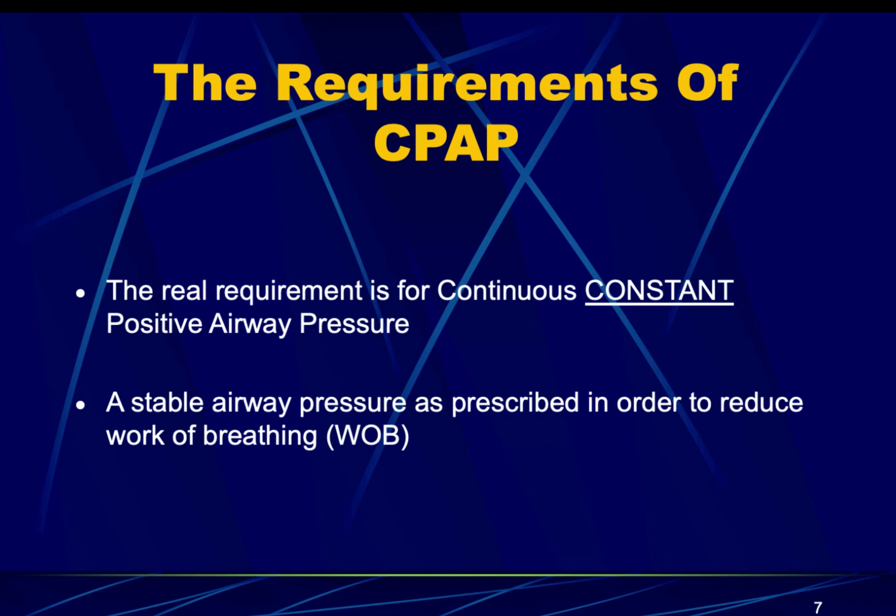It works very well. It's very efficient, especially if you guys are using it accordingly. And just like I said in that last slide, very little PEEP can really do wonders and help the clinical outcome of your patients. We are looking for that constant airway pressure when we're using it, right?